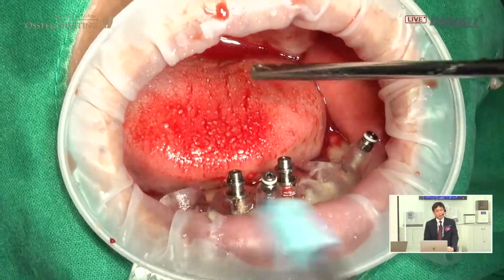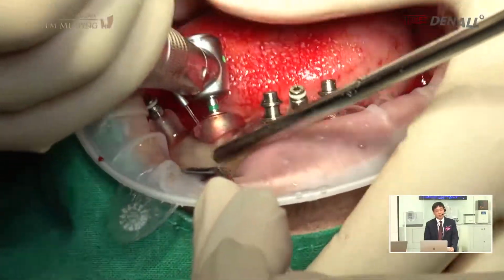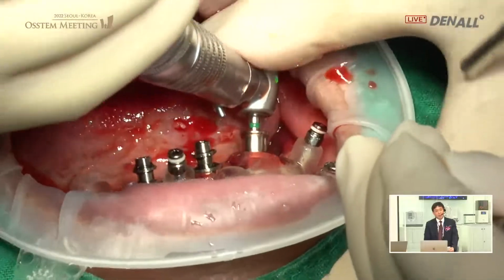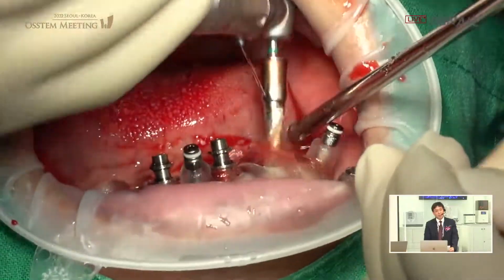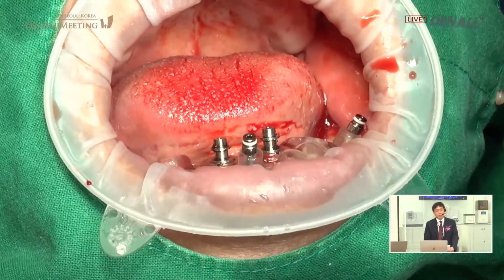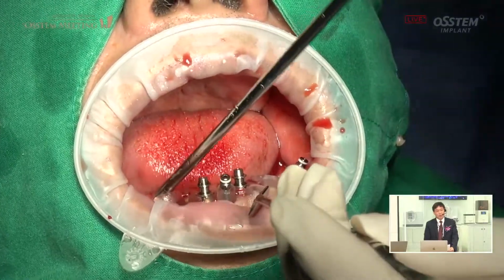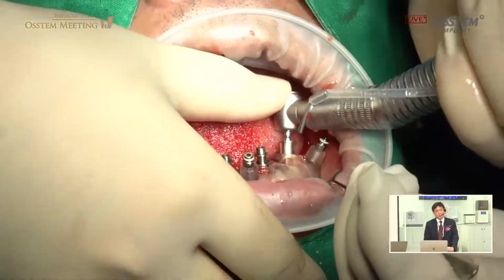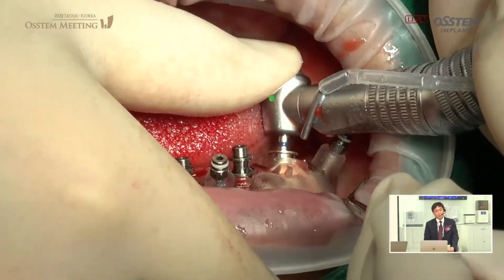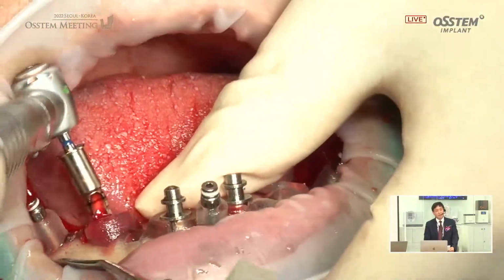As Professor Park mentioned this morning, in order to prevent the drill from slipping, in the case of an extraction socket, the path drill needs to be used. The OneGuide drill is a taper type. In the anterior area, on the slope of the extraction socket, you need to pay attention so that the drill does not slip.